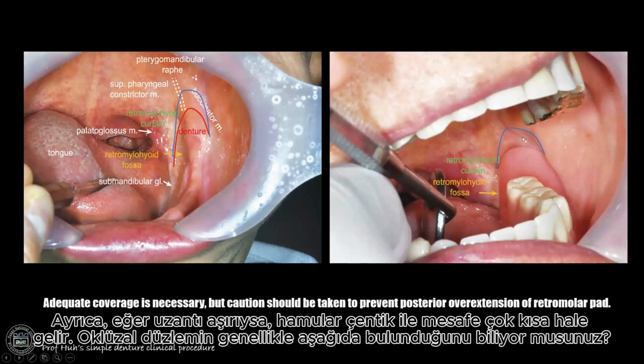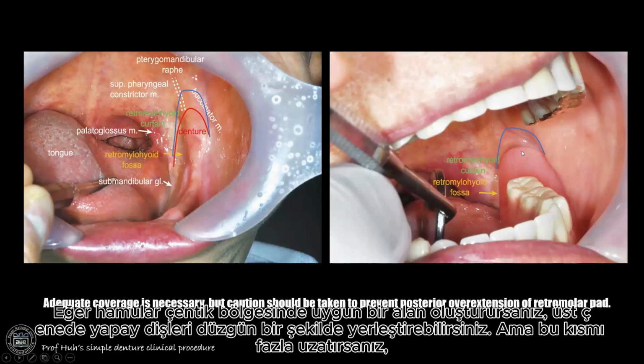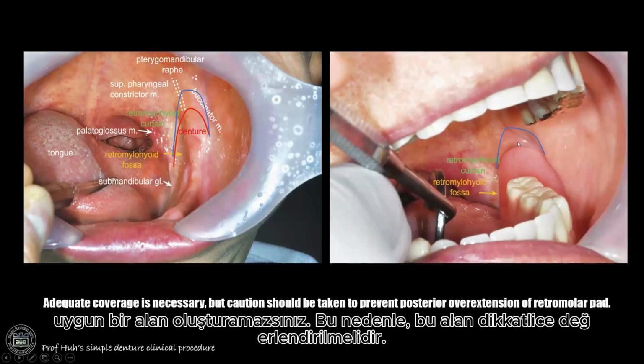The occlusal plane is generally located about 0.8 to 1.0 centimeter below. So if you make the proper space in the hamular notch area, you can arrange the artificial teeth properly in the upper jaw. But if you overextend this part, you cannot make the proper space. So therefore, this area should be carefully evaluated.